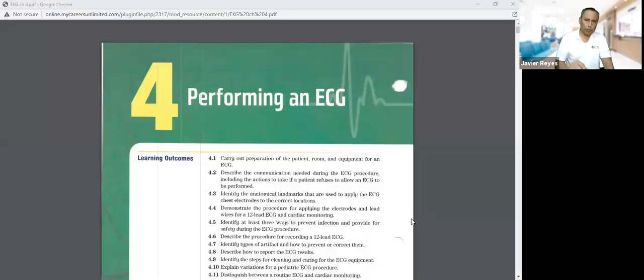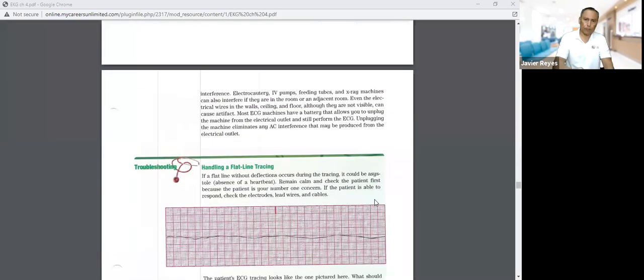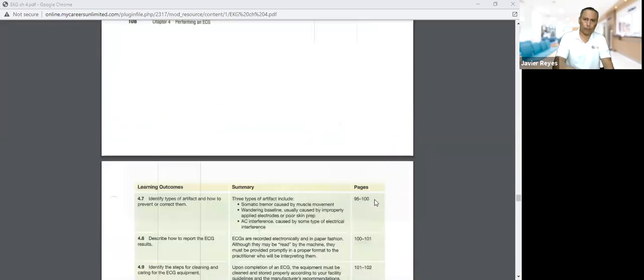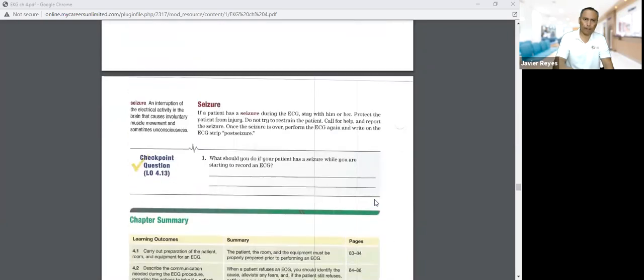What is artifact? We said that this is electrical noise, right? I'm going to share with you pictures of artifact. Oops, I think I went too fast.